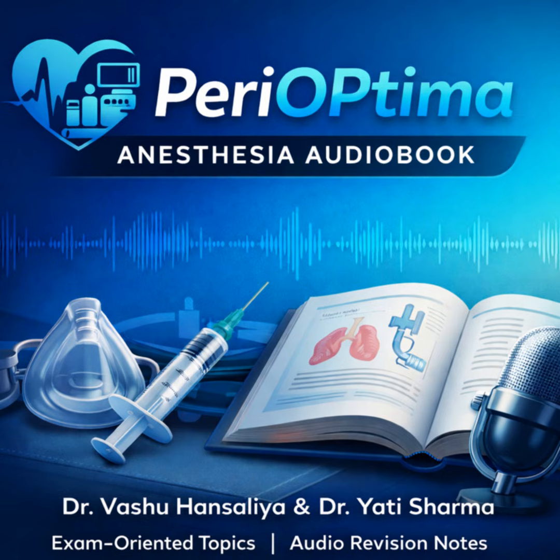But you still have some oxygen flow available. Importantly, yes, the machine usually retains a functional flow of pure oxygen at the O2 flush valve. This lets the operator manually flush the circuit, assuming there's some residual gas in the cylinder. The whole response prioritizes life-sustaining O2 over anesthetic efficacy.